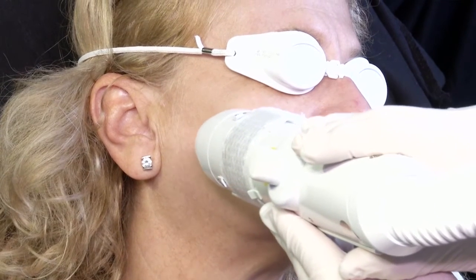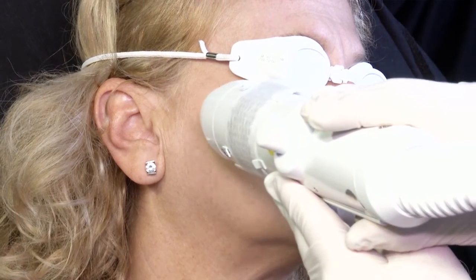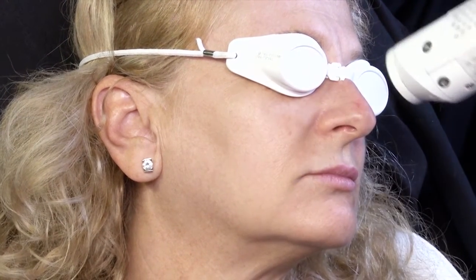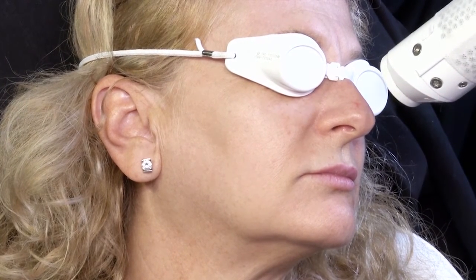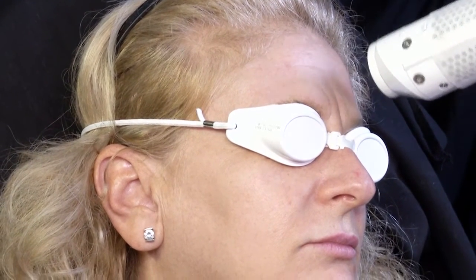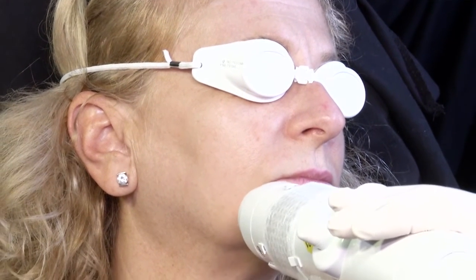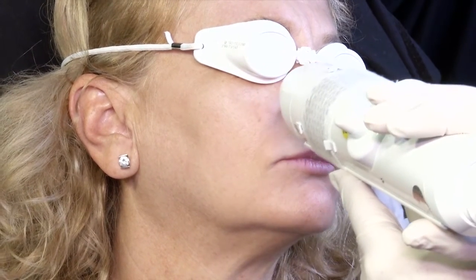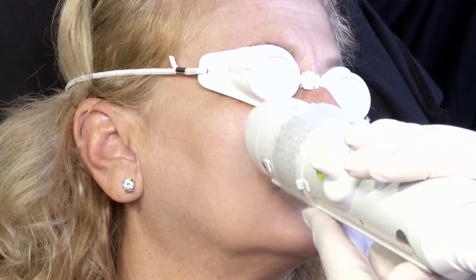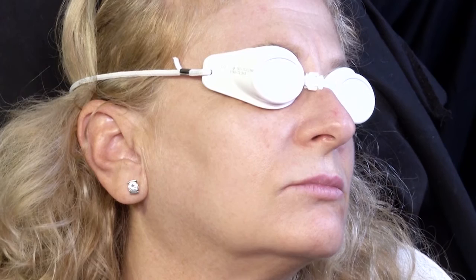The last treatment you're going to see today is the Cytan Diva device for vaginal rejuvenation — I'm not going to be combining that with this. I've gone over this area a couple of times, which is what I usually do. There are really no discrete endpoints; I just want to cover the whole area. She's not getting red at all — it's so gentle that if I hit an area two, three, four times, it's not going to cause any problem. That's the neocollogenesis — I use the 1064 nanometer wavelength with the 650 microsecond pulse duration.